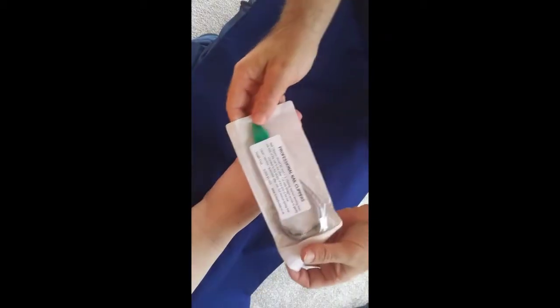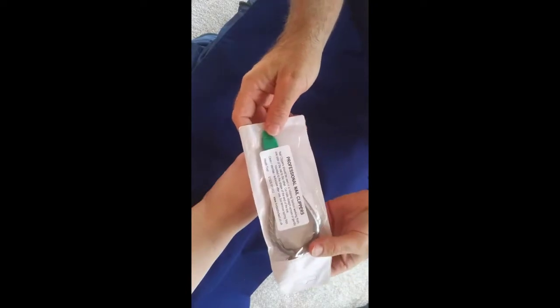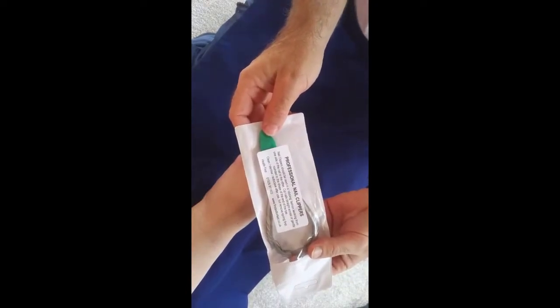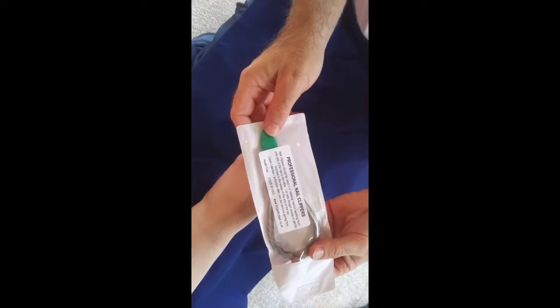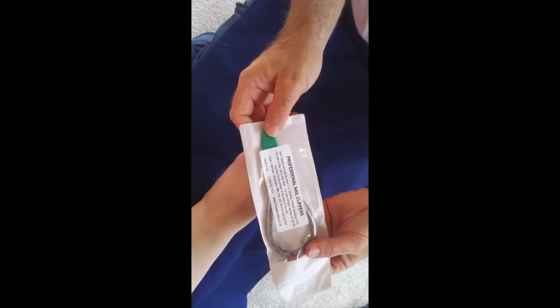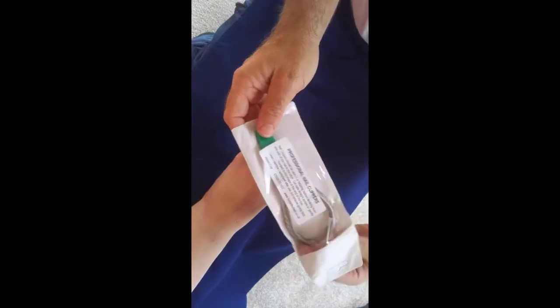Welcome to First Aid for Feet instructional video for our professional nail clippers. The nail clippers come in a pack with instructions that say nail clippers should be used in a nibbling fashion, working from one side of the nail to the other. Cut the nail straight across or gently round it to the shape of the end of the toe, and then you can clean, sterilise, or autoclave after use but remove the spring first.